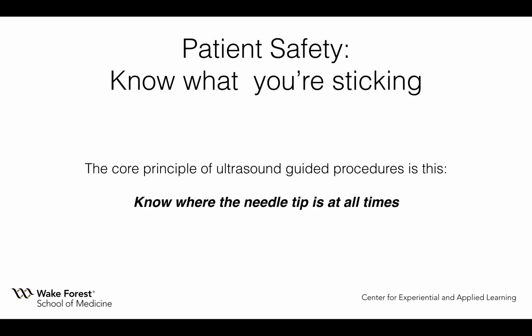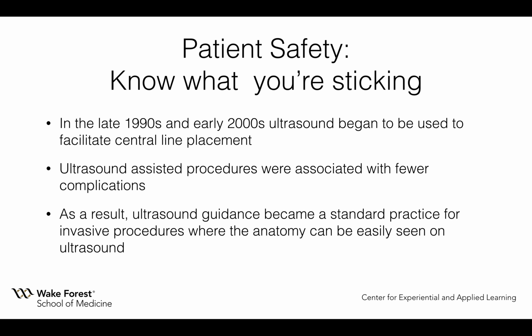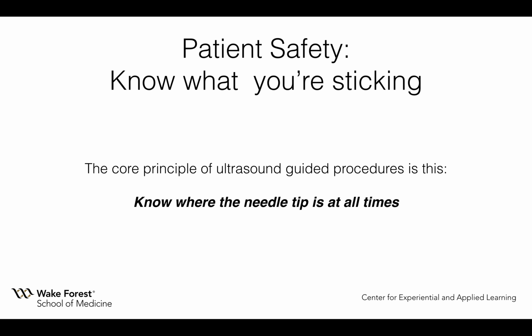The fundamental principle of ultrasound-guided procedures is that we need to be able to keep the ultrasound image and the needle tip visible at all times. The core principle of ultrasound-guided procedure is that we should always know where the needle tip is at all times. So there should never be a point during the procedure where the needle tip location is unknown.